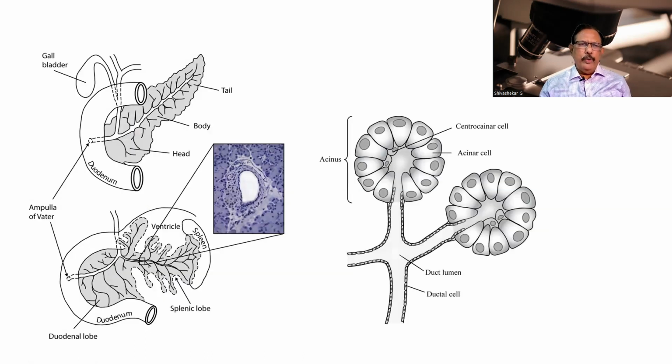Now comes the important one. So I find that it is a lobulated structure and it is somewhat, I won't say pyramidal, but leaf-like in outline. I'll go to the anatomy at a later date. The gallbladder, etc. And along with the pancreatic duct, they drain into the ampulla of Vater over here. That is shown. What I'm interested in, these are all the pancreatic glands over here, and this is a duct. And this is a supporting stroma.